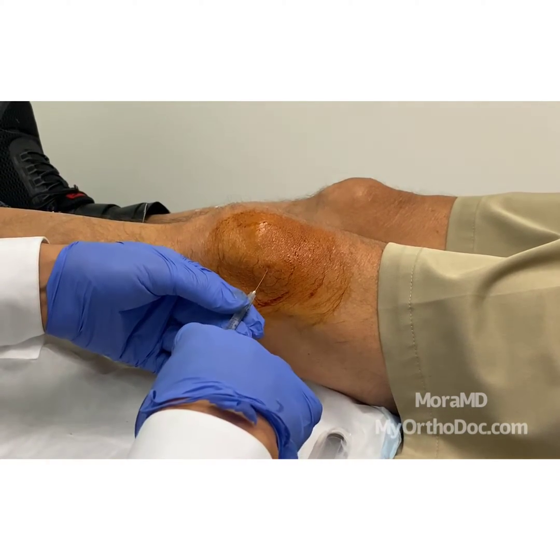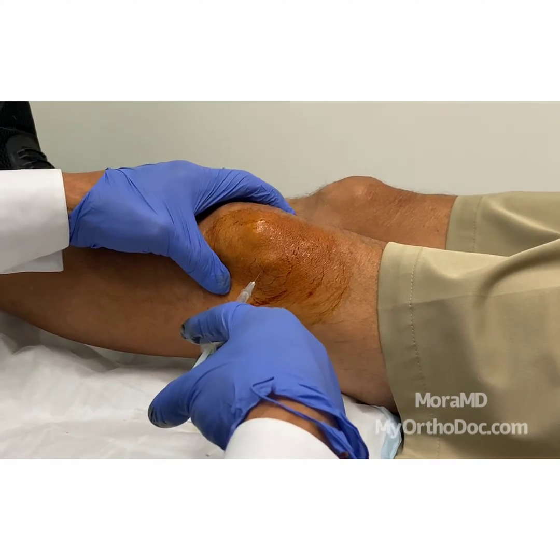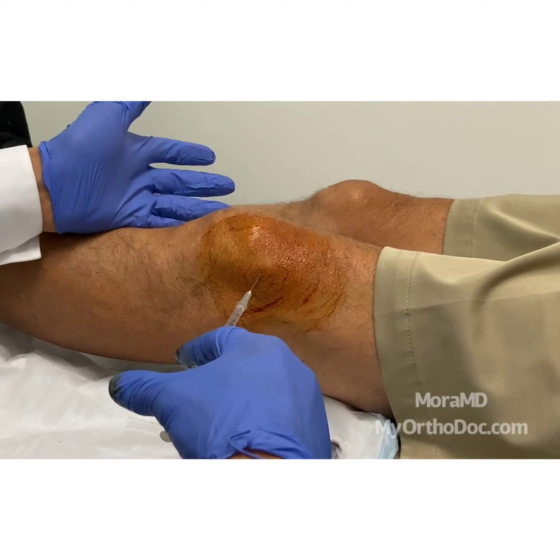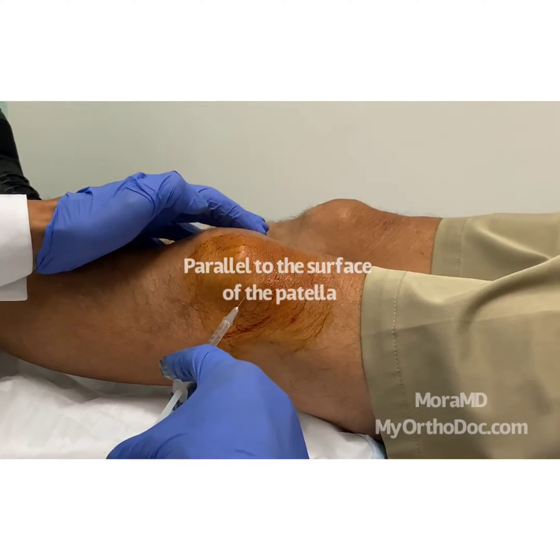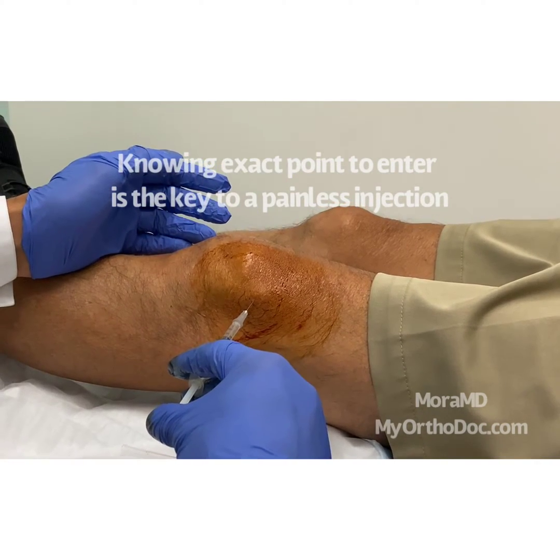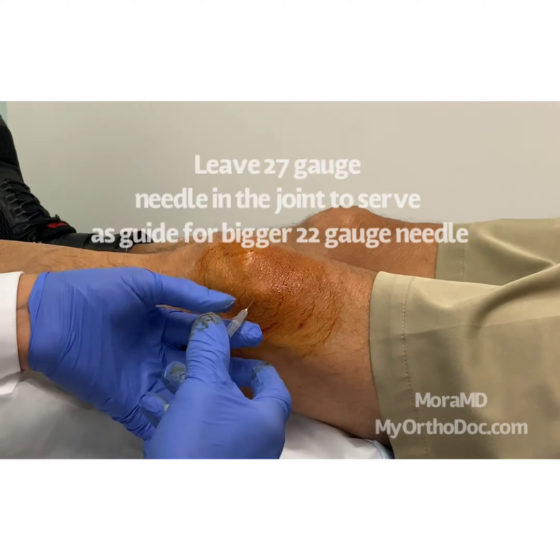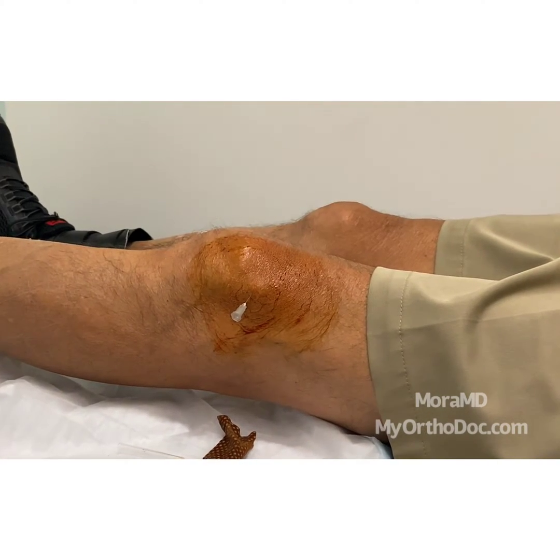Are you doing okay? Good. So we go like this — I'm angling the needle parallel, not angling it this way. Then we go in like that and numb it up. I know I'm in the joint; I'll confirm in a second with my ultrasound. I'm going to leave that 27-gauge needle in there and switch it over to a 22 on my syringe.